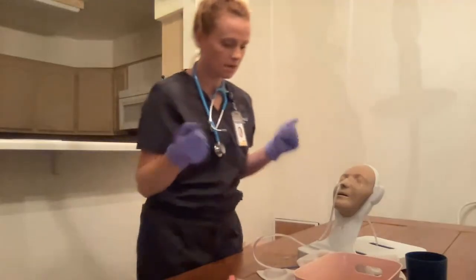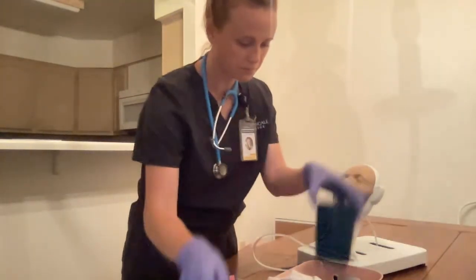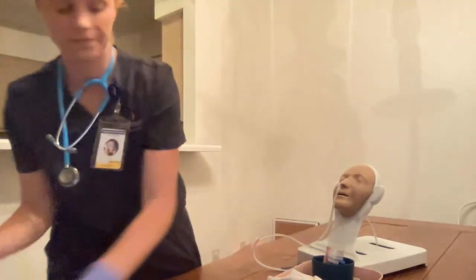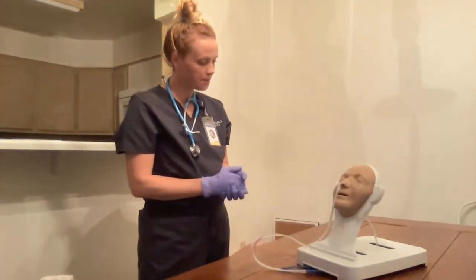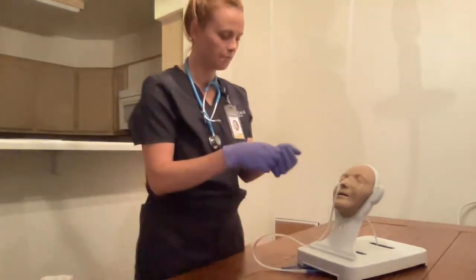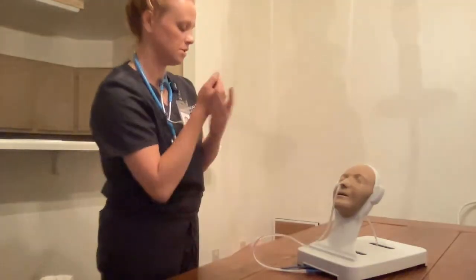Okay, that's it. I'm going to clean up Mrs. Smith. Give me just a second. Dispose of these. Move this aside. All right, Mrs. Smith, are you comfortable how you are? Good. Okay, I'm going to lower the bed back down. Remove my gloves. Dispose of them. And hand hygiene.